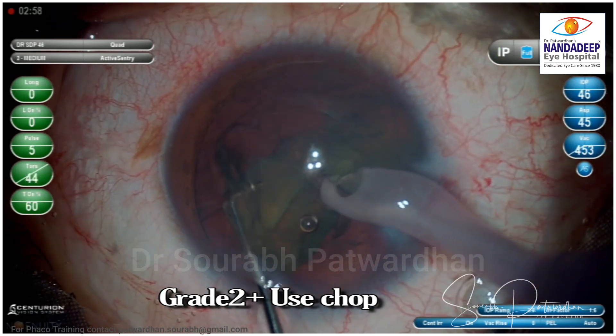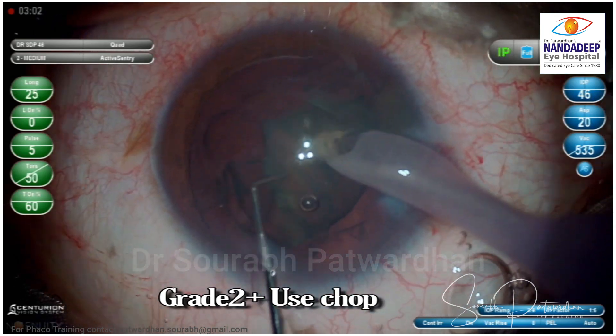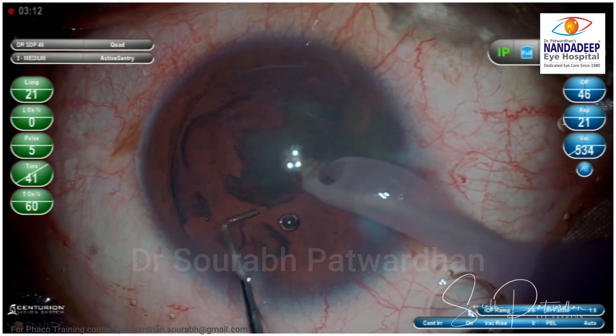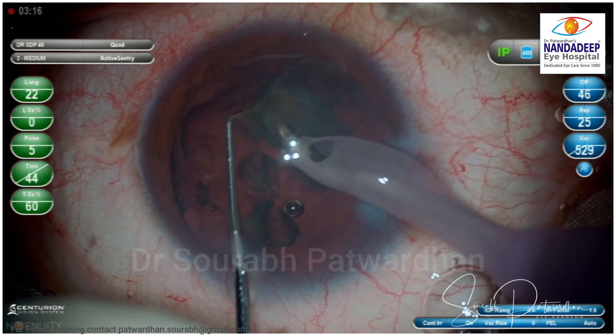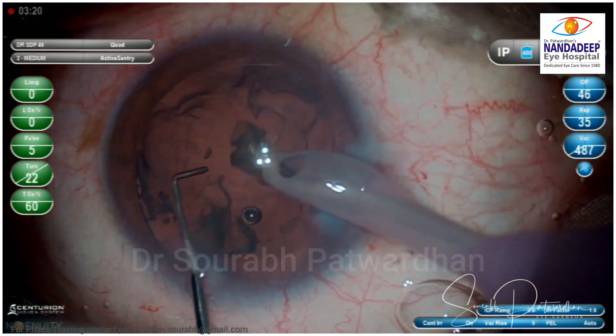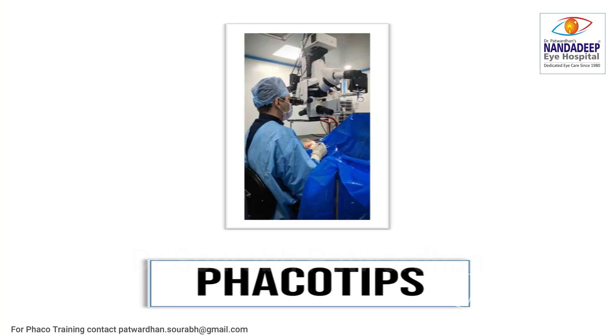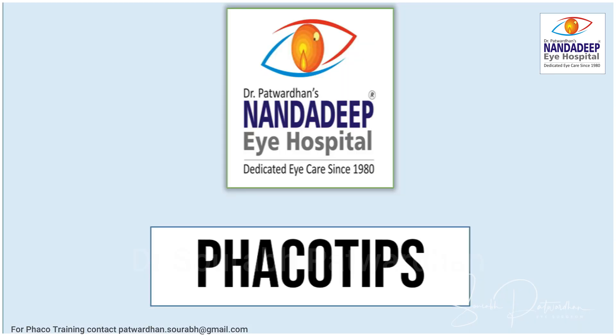So if you have grade 0 or grade 1 cataract, I think this technique works beautifully if you use the three things mentioned in this video: first, the correct place of hydrodissection to get a well-positioned nucleus prolapse; second, the use of the second instrument behind the prolapsed pole; and third, doing high flow rate and high vacuum with the feco tip.